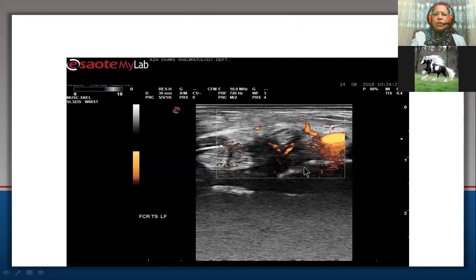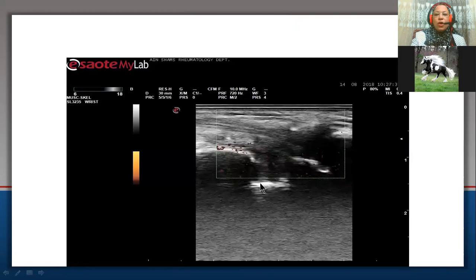At the same time, there was a step or defect at the left scaphoid bone. On examination of the flexor carpi radialis tendon longitudinally till its insertion into the second and third metacarpal bones, the tendon near its insertion was swollen and hypoechoic, which indicates the presence of tendinopathy or enthesopathy of the tendon.